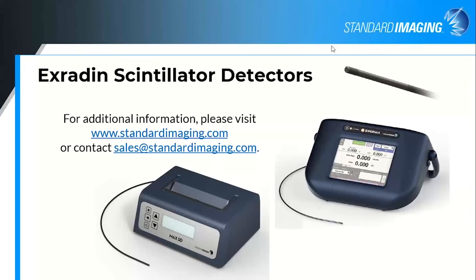There's a question from Yasmin. Is there anything these detectors can't do? They're not so good at big fields. They really are specifically targeted for small fields. Once you get into larger fields, then your Cherenkov correction provides a little more uncertainty just because of the magnitude of the Cherenkov signal compared to the magnitude of the scintillator signal. So they really are specifically for the smaller field measurements.